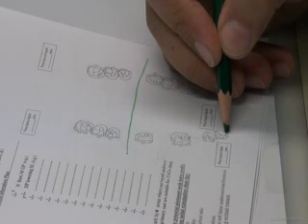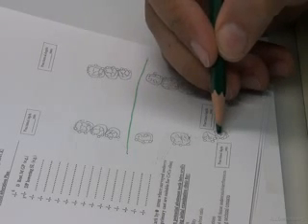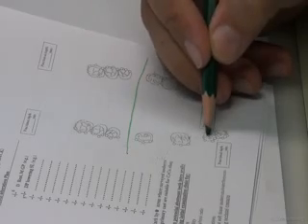I have double rests: a cingulum rest here and an occlusal rest here. But of course the 4 has another adjustment. Lower 4. This is specifically lower 4. Can the technician here see the type of the 4? Lower 4? Do you remember the developmental variations between 4s? There are lower 4s with complete lingual cusp.